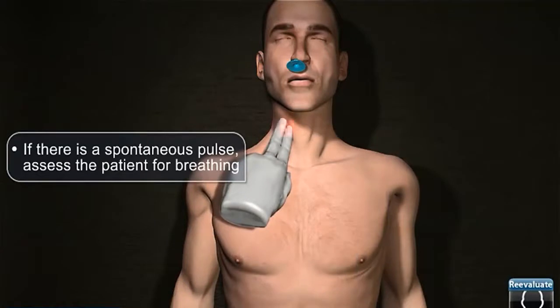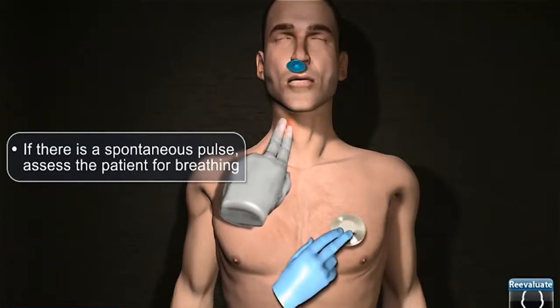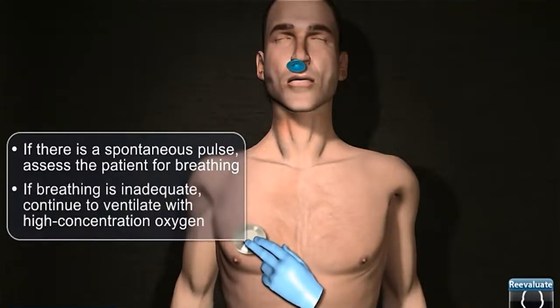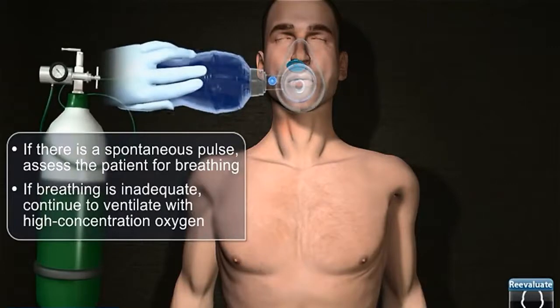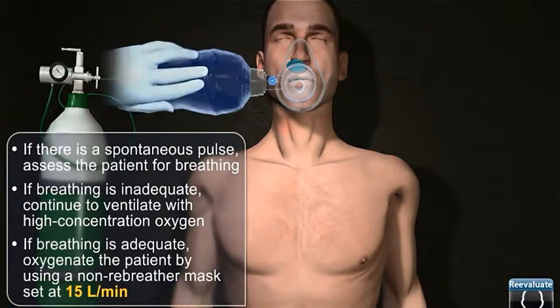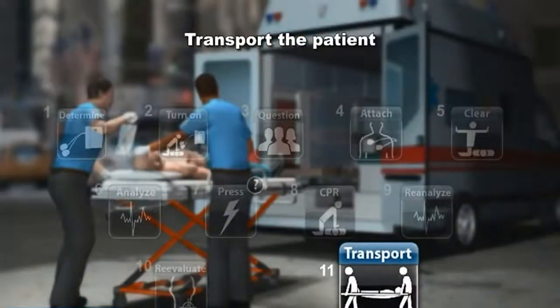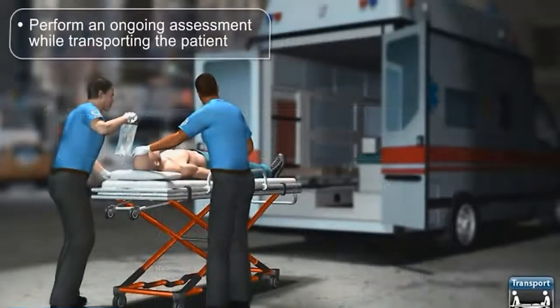If there is a spontaneous pulse, assess the patient for breathing. If breathing is inadequate, continue to ventilate with high concentration oxygen. If breathing is adequate, oxygenate the patient by using a non-rebreather mask set at 15 liters per minute. Transport the patient. Perform an ongoing assessment while transporting the patient.